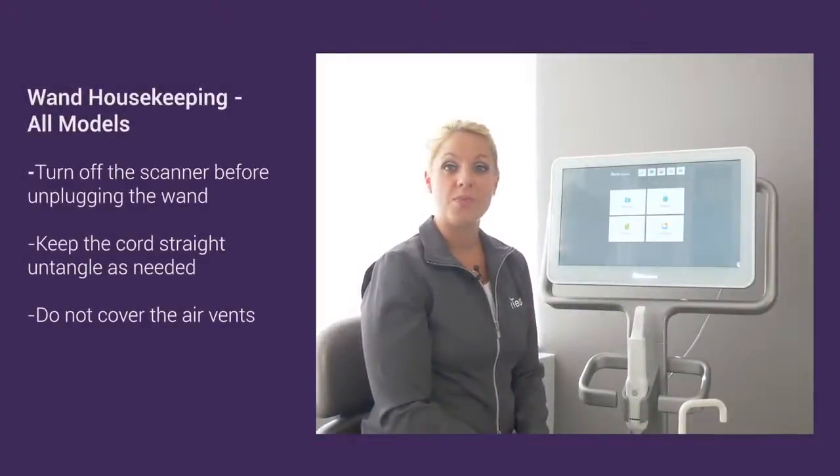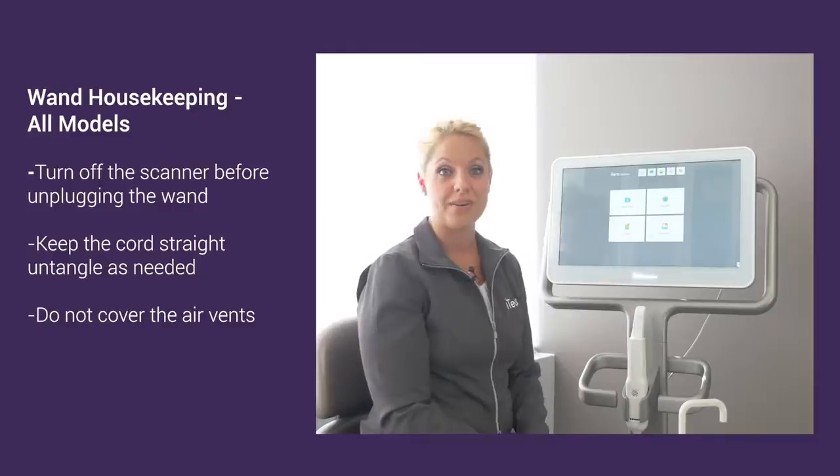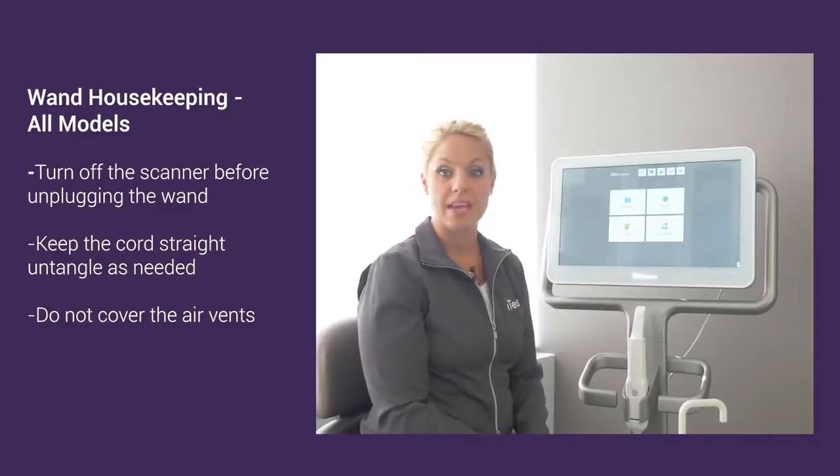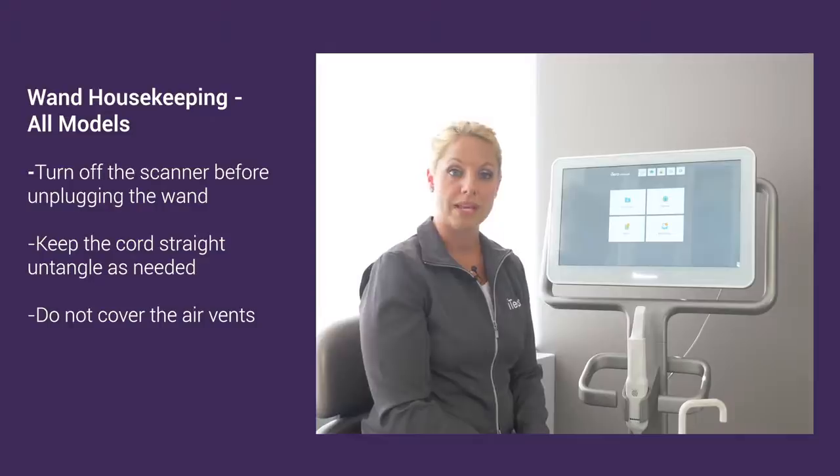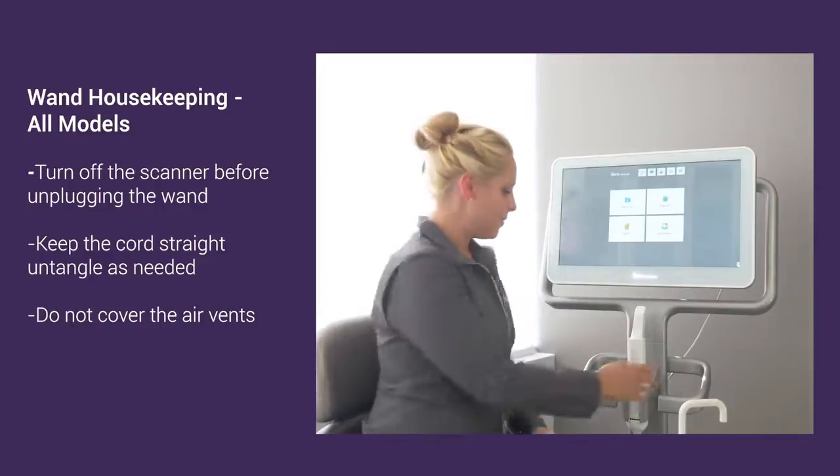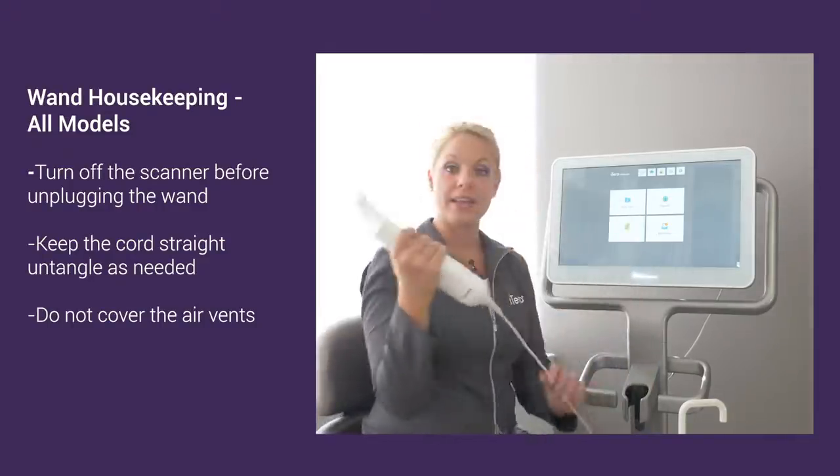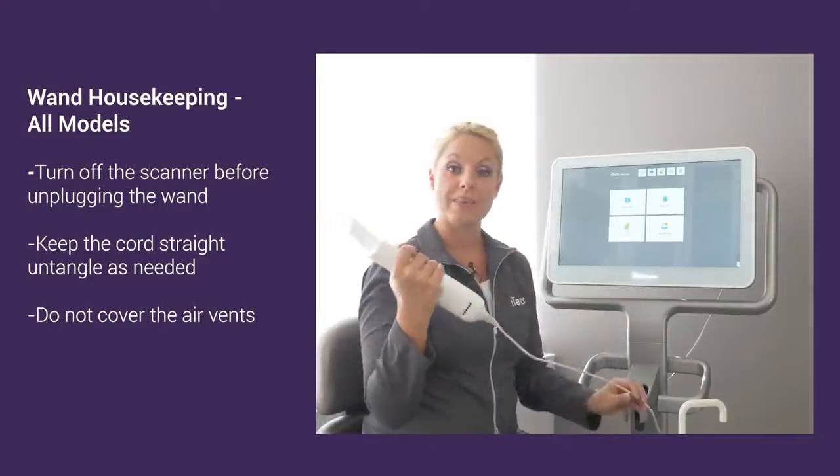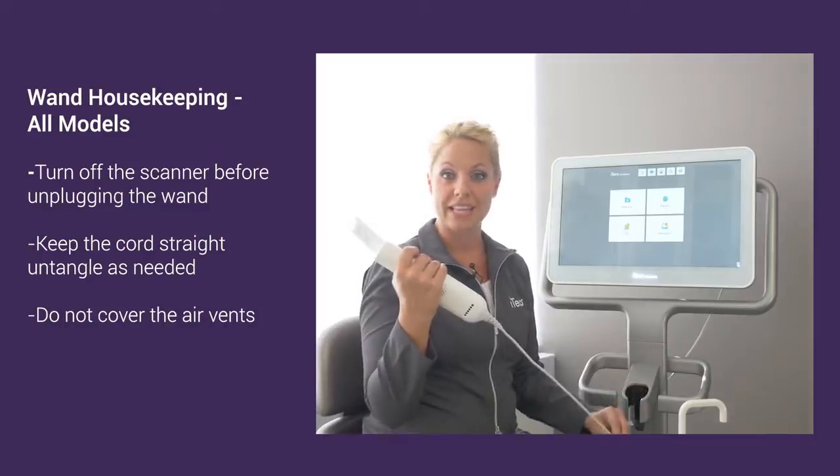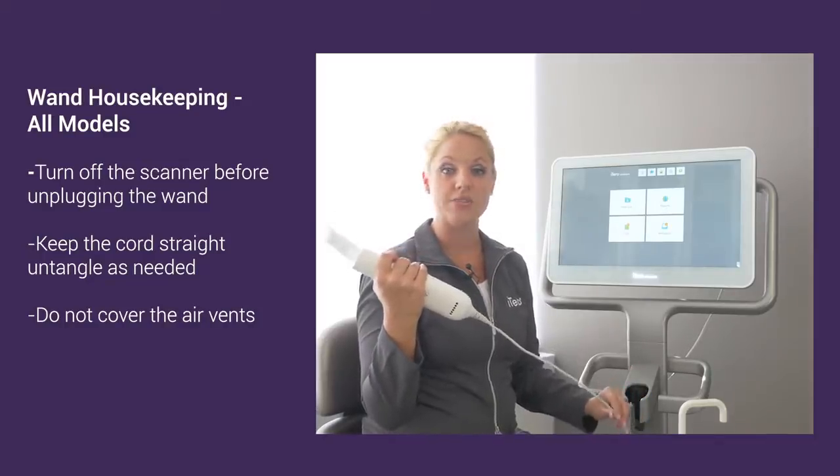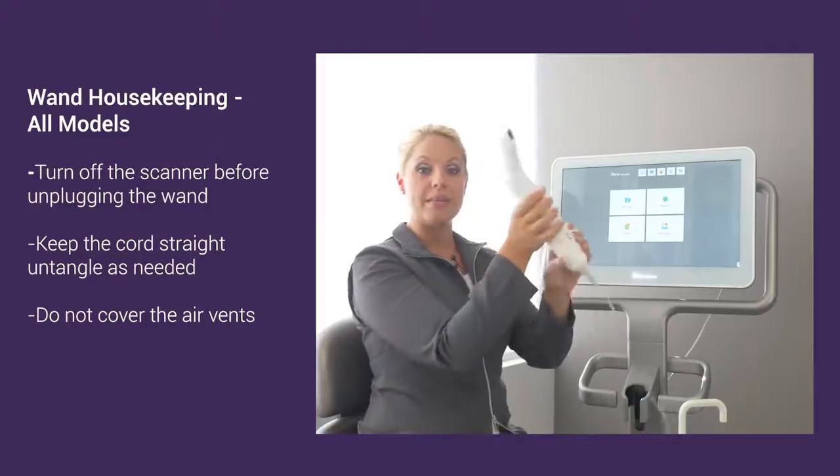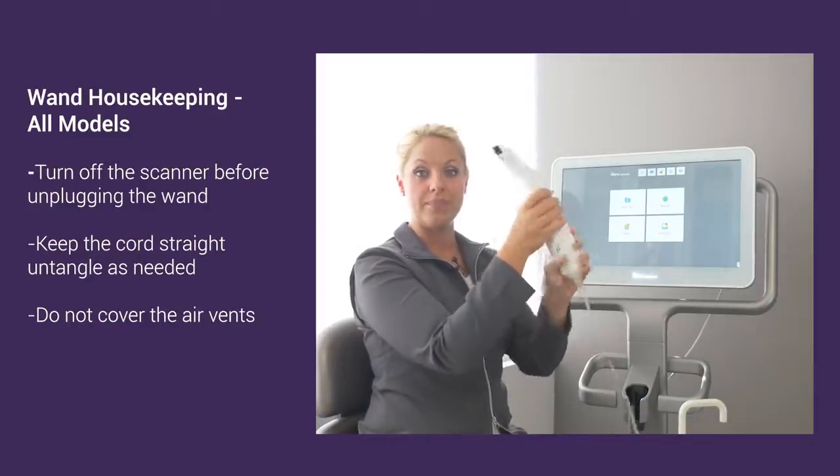For care of your wand, regardless what model scanner you have, we need to make sure that the scanner is powered off before unplugging or plugging the wand in. With the wand and cord, we want to make sure that the cord is hanging freely and not twisted or tangled. If it is, you can always untangle it by turning the wand accordingly.